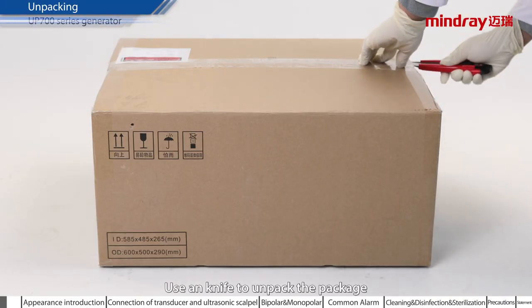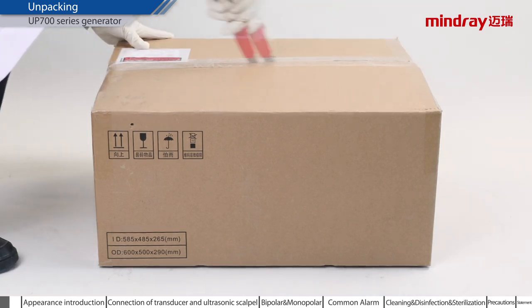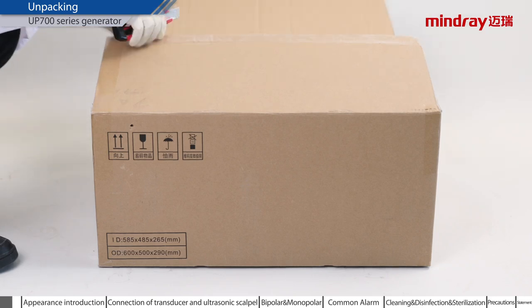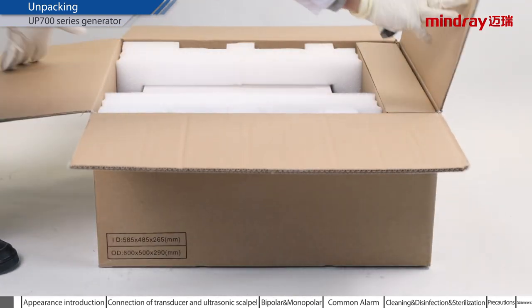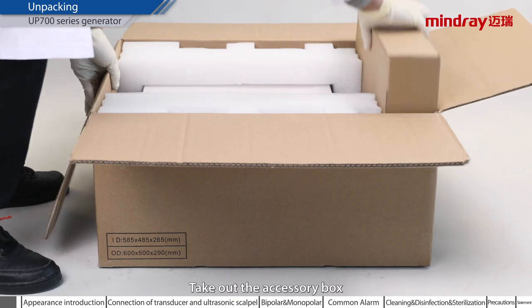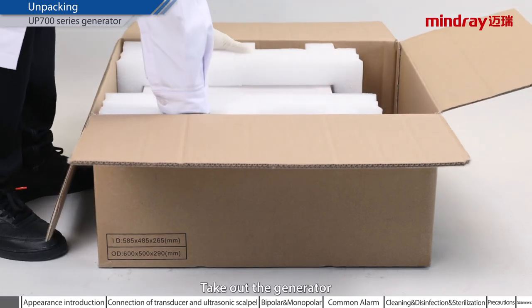Use a knife to unpack the package. Take out the accessory box. Take out the generator.